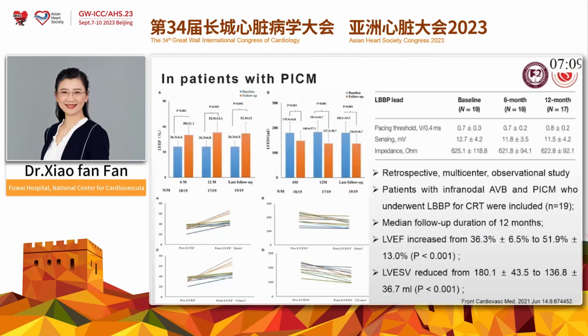Yeah, this study is from Professor Huang. They studied the LBBP in patients with PICM, pacing-induced cardiomyopathy, and the follow-up duration was 1 year. And they found the LVEF could increase significantly from about 36% to 51%.